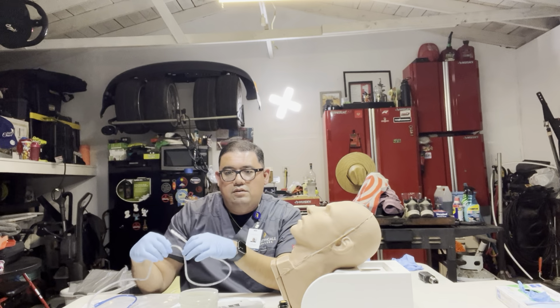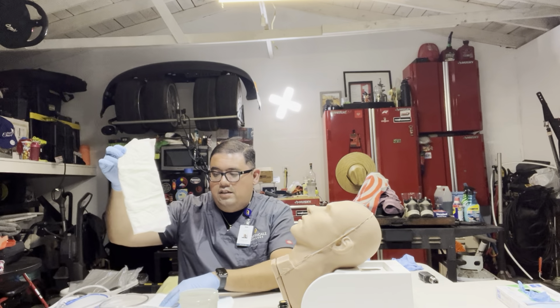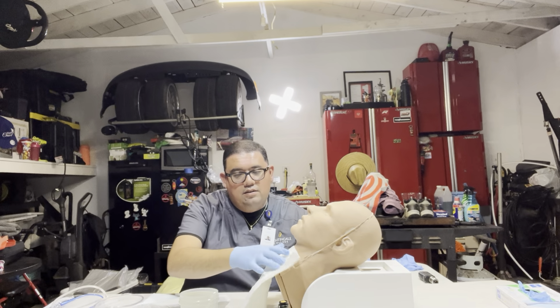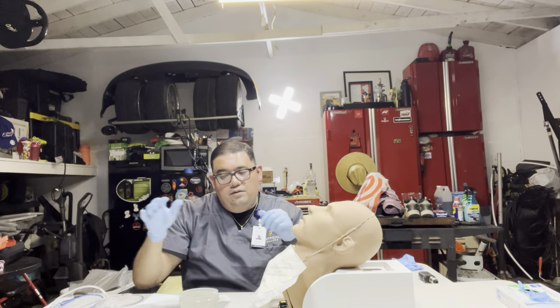Alright, James, I'm gonna go ahead and place the towel on your chest area so it won't make a mess on you, alright? Perfect.